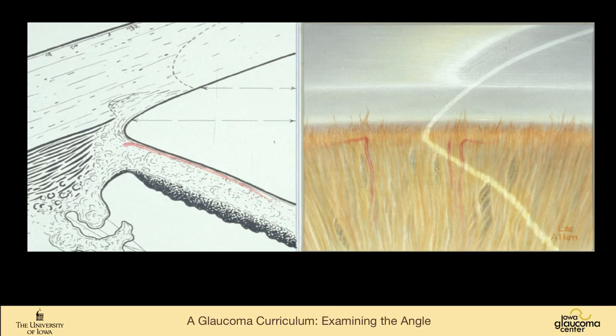This inserts right at the scleral spur. The opening here is quite wide at 50 degrees. It's flat and no pigmentation. So C50F0.